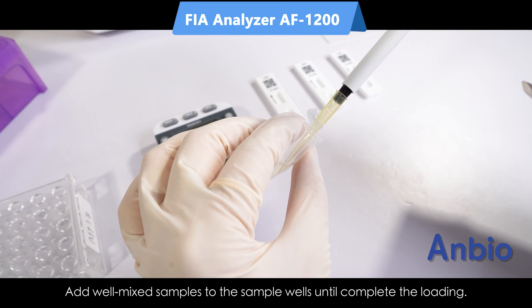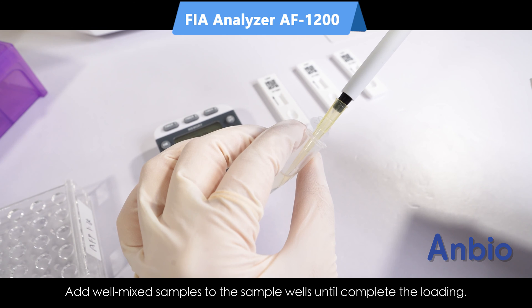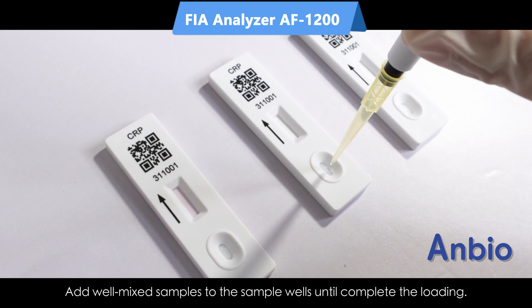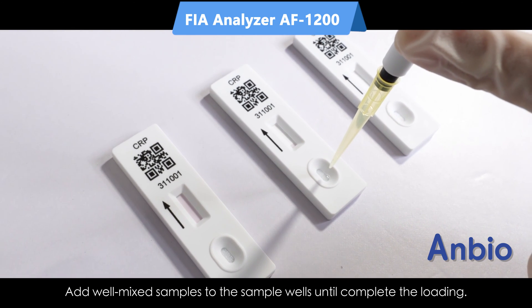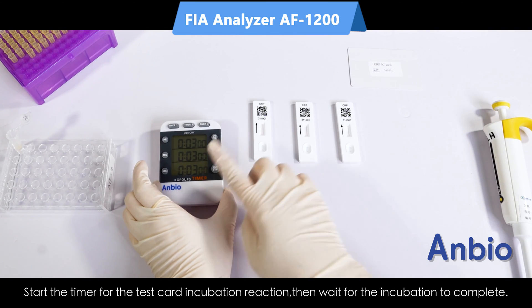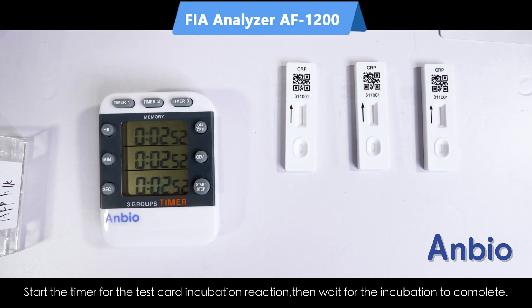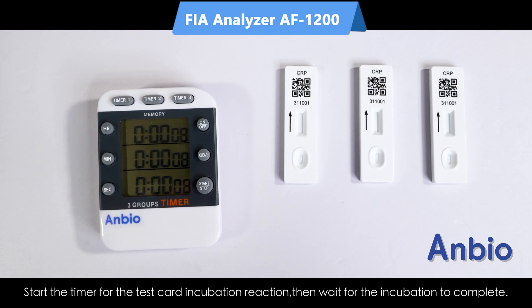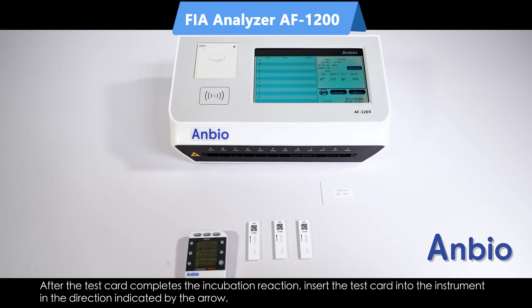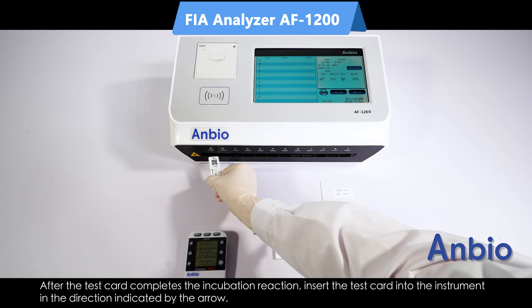For quick test mode, the user needs to add well-mixed samples to the sample wells until the loading is complete. Start the timer for the test card incubation reaction, then wait for the incubation to complete. Under quick test mode, the test card needs to complete the incubation reaction outside the instrument. It is prohibited to insert the test card into the instrument in advance.